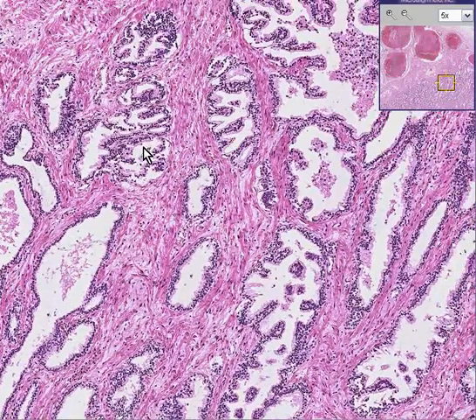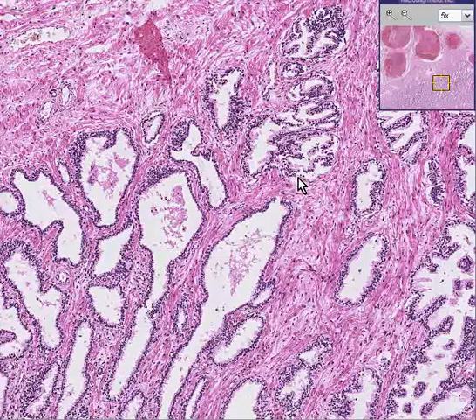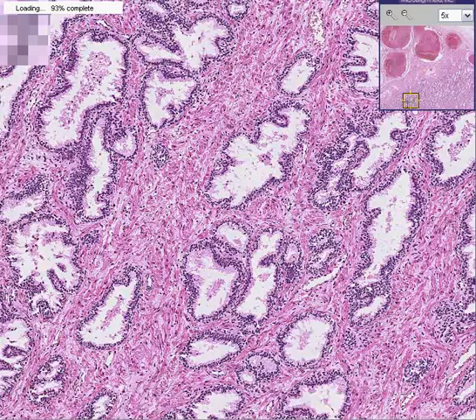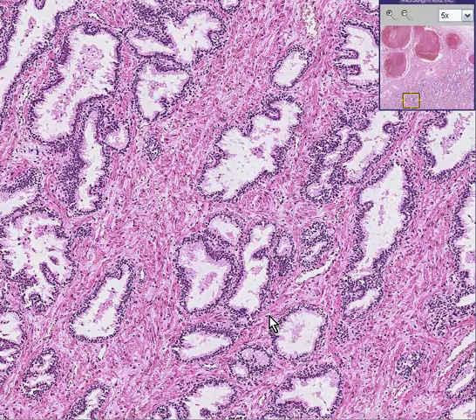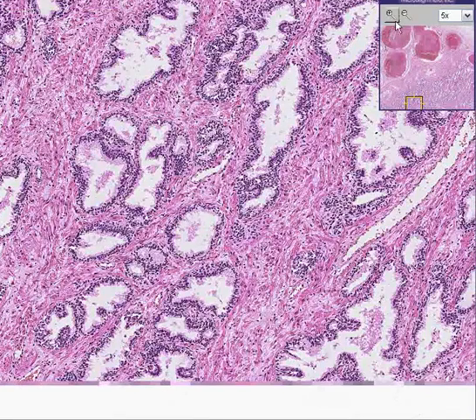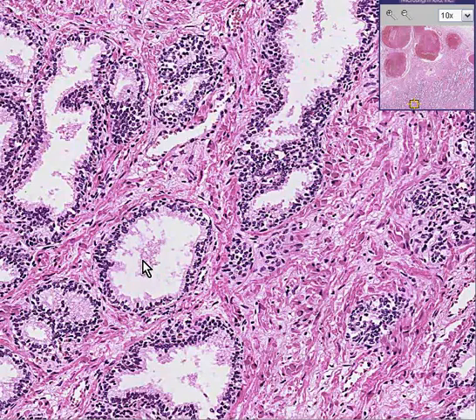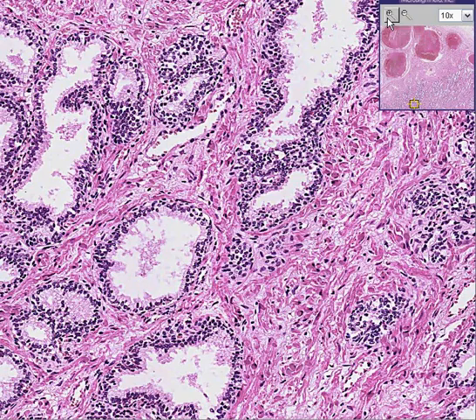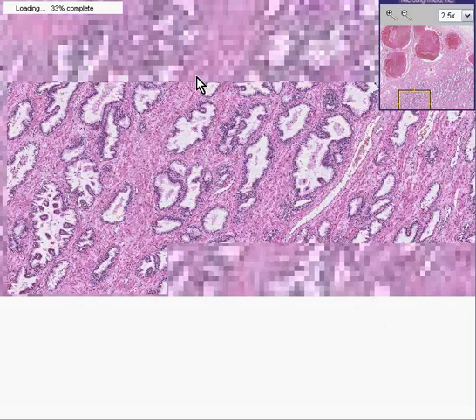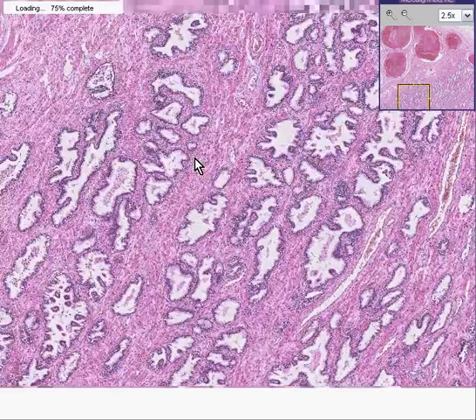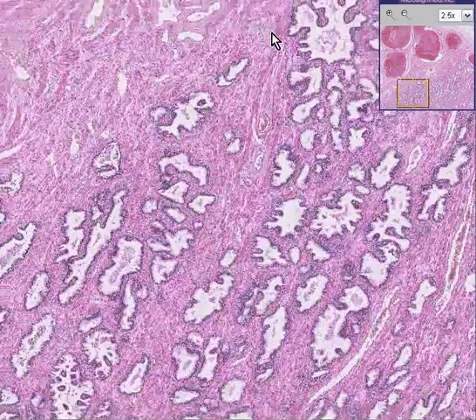If you saw prostatic concretions, which we might be able to find if we look around enough — prostatic concretions are when the prostatic secretions become indurated and show kind of a lamellation, those classical features. I don't happen to see any here right now, but I don't want to waste your time looking for them. This is a prostate gland.